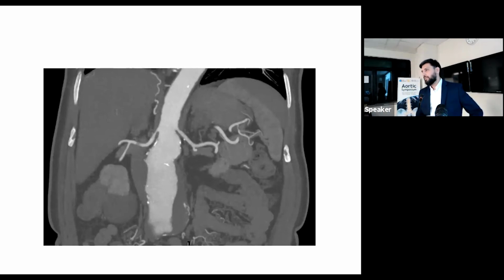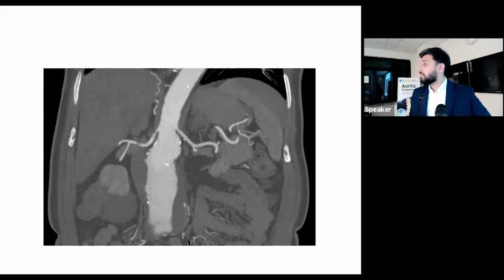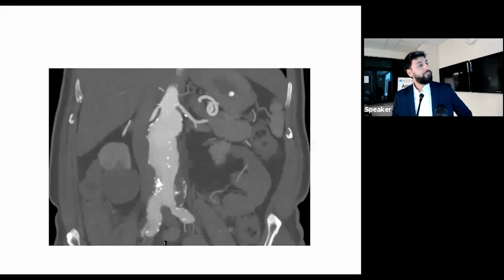With the fenestrated endovascular aneurysm repair, we need to get a bespoke tailor-made graft from the company, which is designed for that very patient. It can't be used on anybody else. It's a stent graft that has fenestrations or holes for exactly where these arteries are coming out. And it takes quite a few weeks to order. So this is something that requires quite a bit of planning.